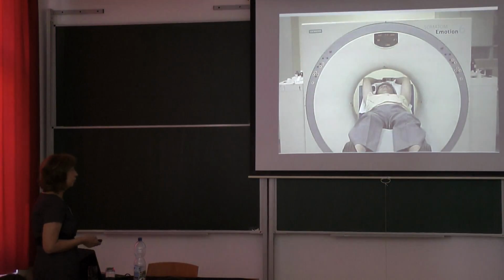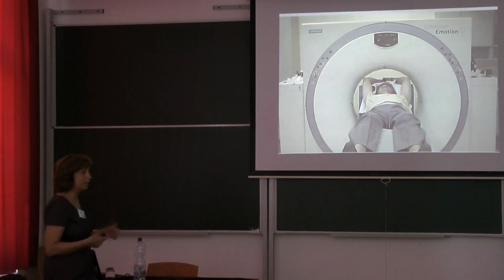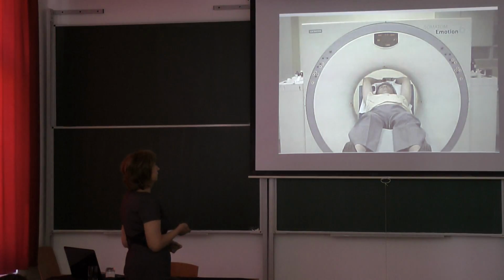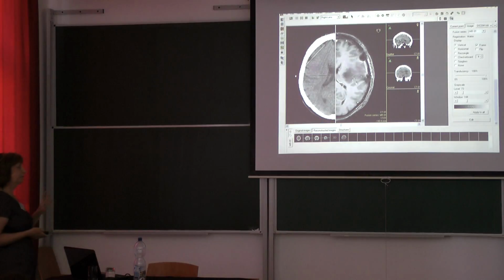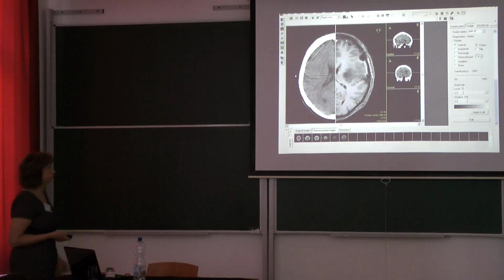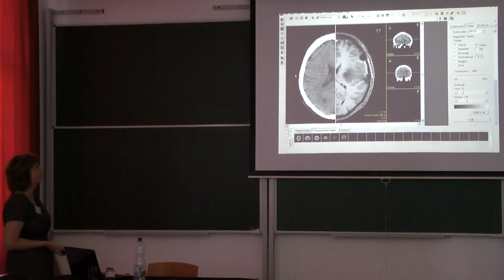and all of these devices should fit into the treatment planning imaging devices. This is, for example, the CT, and the brain can be imaged by MRI without the same fixation, because it's a geometrical body, practically a half spheric geometrical object, so it can be easily fused with CT images.